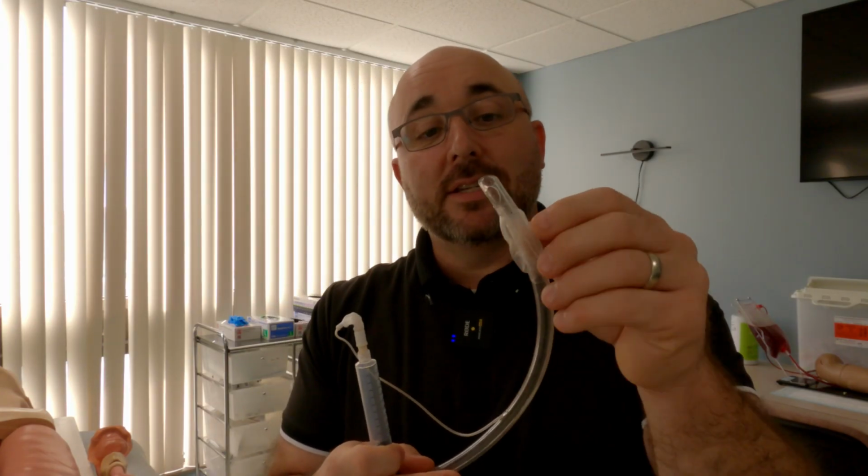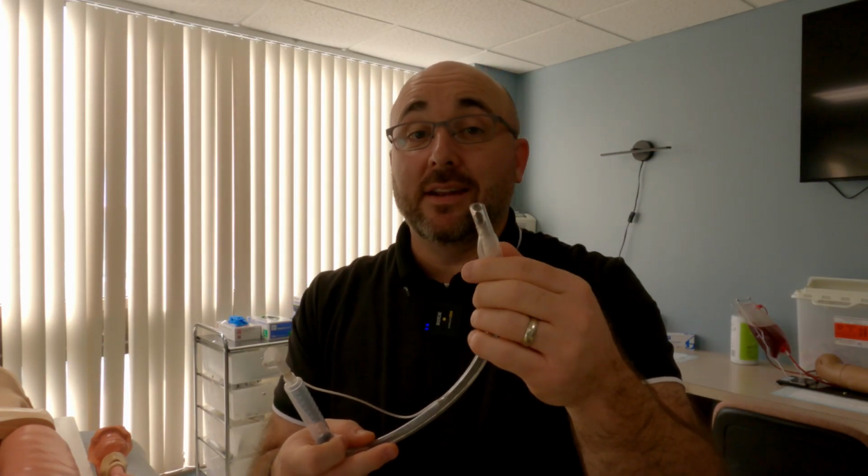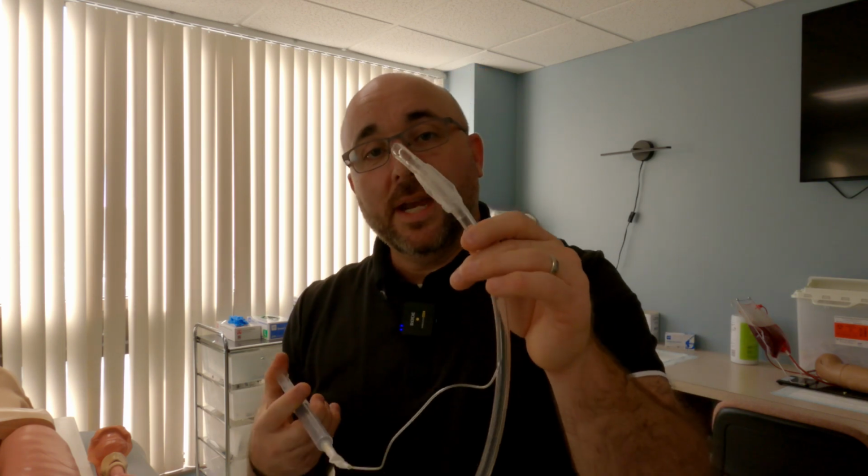So we're verifying that the cuff is intact. And you know, these are kind of cheaply made. They can come from the manufacturer with a cut in it, or maybe somebody was fiddling with it, or it was stuck in a bag somewhere, even inside the package, and it was lacerated. You want to make sure this cuff holds air, has integrity, before you go for the intubation. Just like with the laryngoscope handle, making sure that works, you want to make sure this works first. So setting up the equipment is really important.